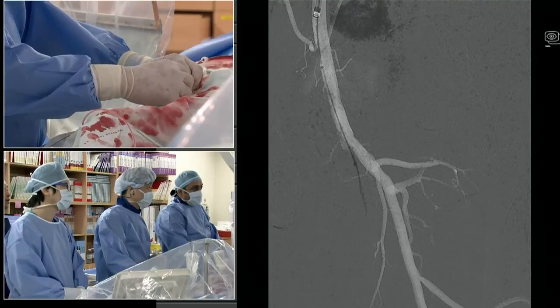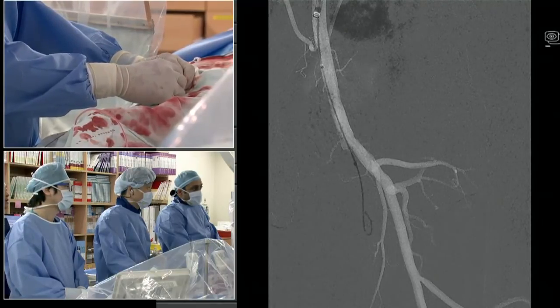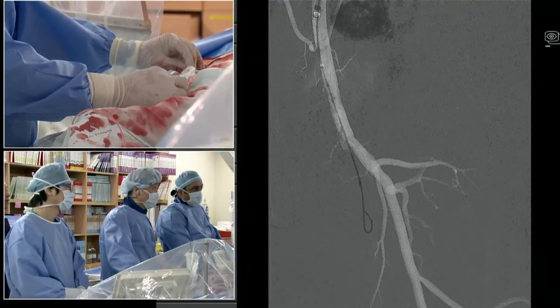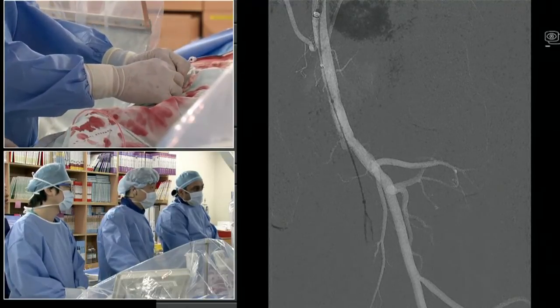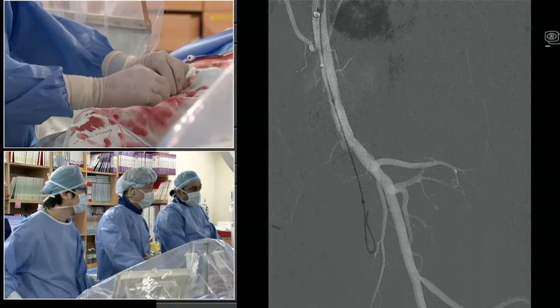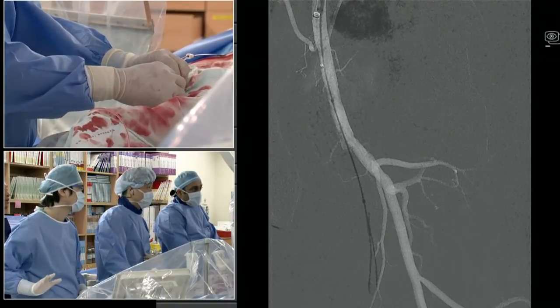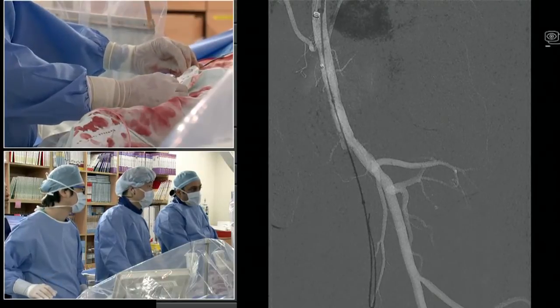So what I'd like to do here is a typical technique of trying to get a J early and keep the J narrow. That's the tried and tested technique. It works well. And if it starts to get too broad, then I know I'm definitely in the wrong spot, but for now it seems to be going pretty smoothly, consistent with no calcium.